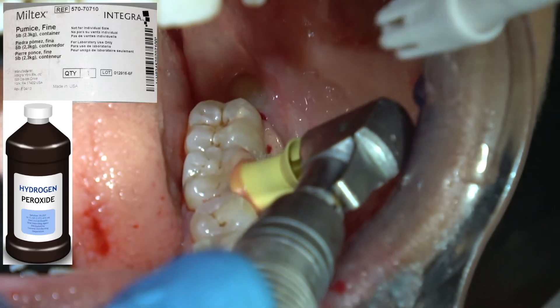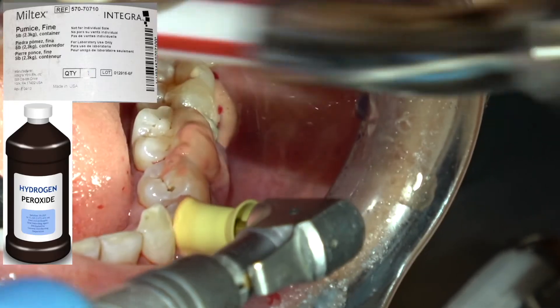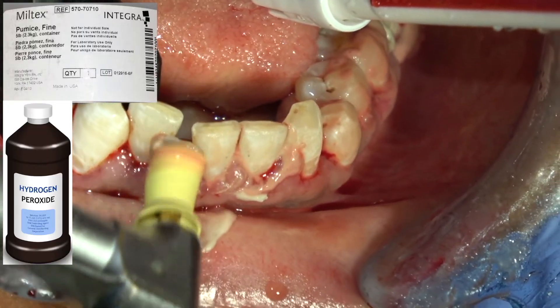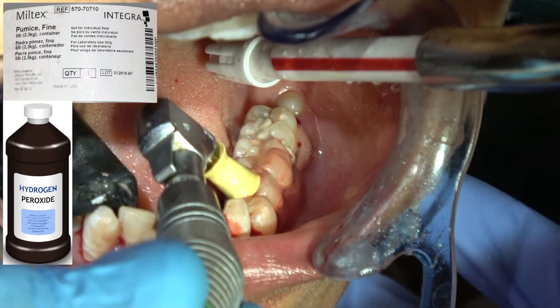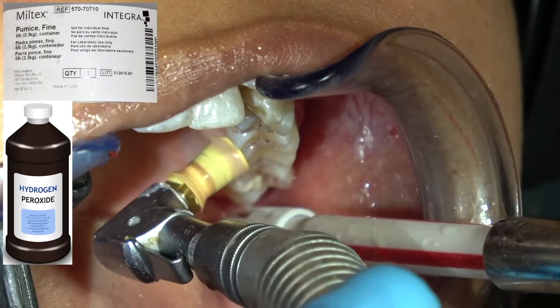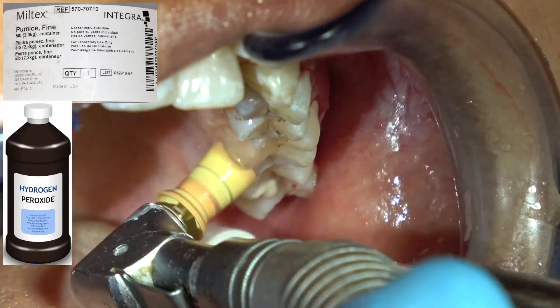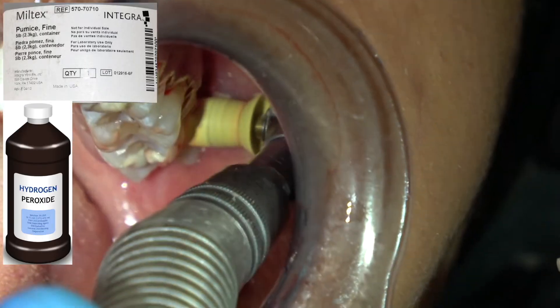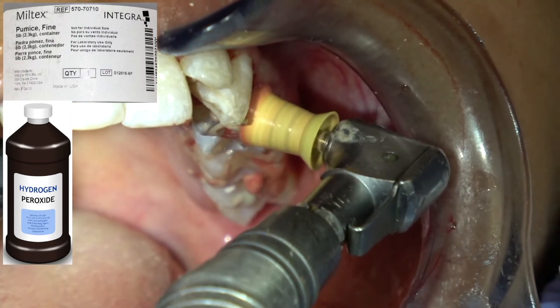We're coming back with some scaling and root planing, then we're going to polish the teeth with pumice and 3% hydrogen peroxide mixed together and polished in a prophy cup. At this first appointment, I primarily want to get everything off the teeth that's subgingival, because the patient won't be anesthetized at the second appointment with my dental hygienist for fine scaling, polishing, and oral hygiene instruction.